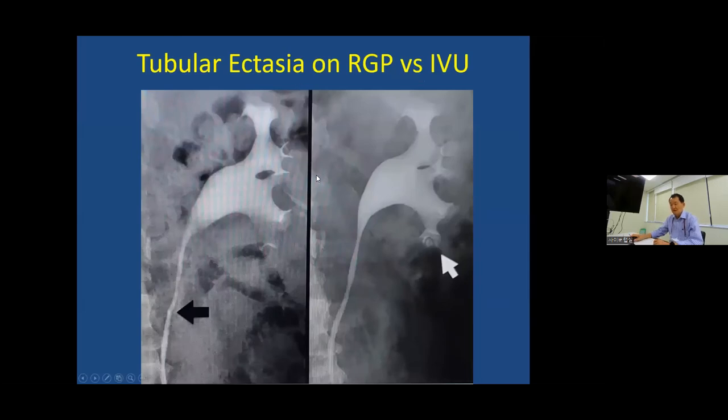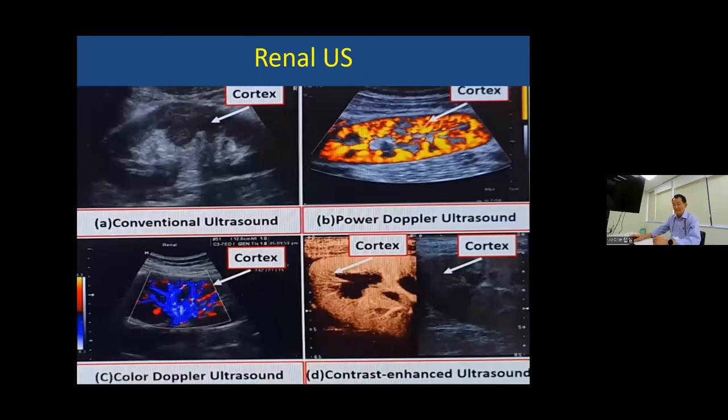Okay, so normally you have a retrograde urogram, we introduce contrast retrograde, and it delineates the renal pelvis, our collecting system, very nicely and sharply. Okay, pyramids here. So there is a little fullness, some ectasia, if we give too much contrast, and some anatomical variation as well.